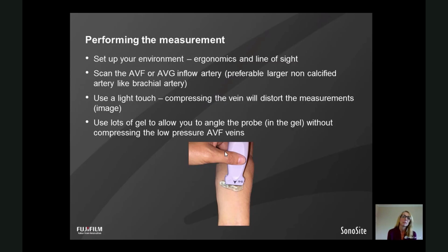So sometimes it's better to scan and have a good look and pick your best. And the best might be the brachial artery. And what I do then is I just document that that's where I've done the measurement. So when I continue to do more measurements to get a trend, I go back to the same place. Use a light touch. Remember not to compress the vein or it will distort the measurements.